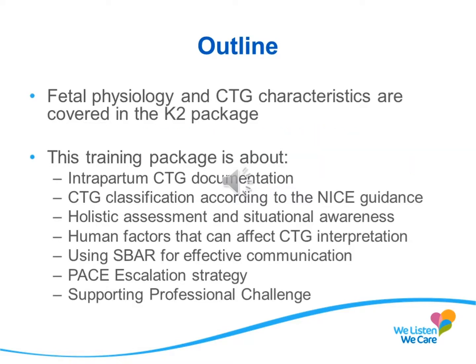Welcome to the NUH Maternity Intrapartum CTG Interpretation and Communication Learning Package. This package is designed to be used together with the K2 package and does not duplicate or replace the learning within K2.